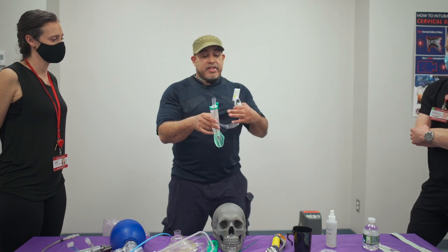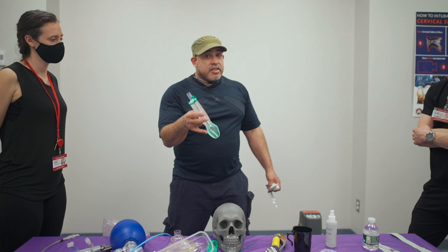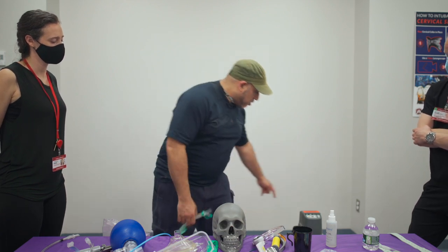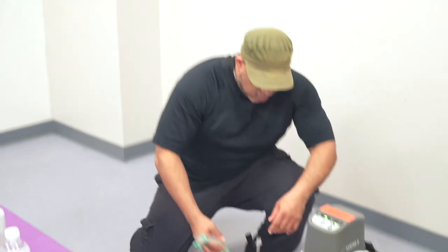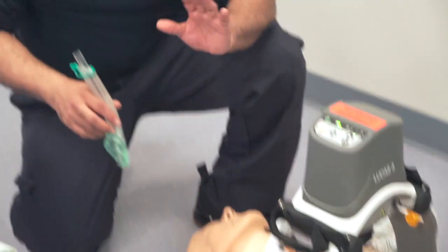Ideally, you put in a supraglottic airway. This happens to be something that looks like an LMA. I'm not going to say the brand name, iGel, but this device works. And the reason I'm telling you this is if I put the patient up with CPR, now some people's CPR is more vigorous. This Lucas, maybe not as vigorous as my CPR, but during this CPR, I don't have to stop my CPR to do something very unique. So this, I bias and I call a Torres grip.